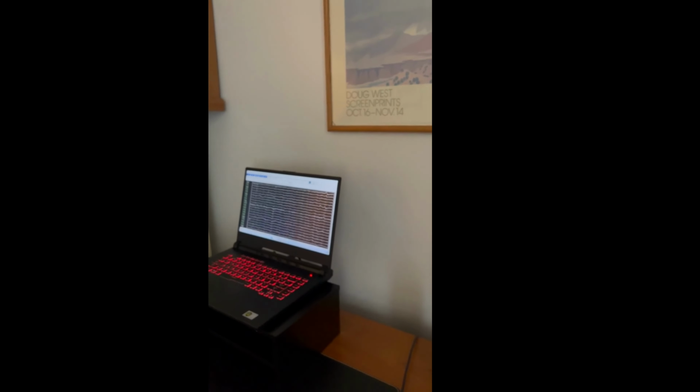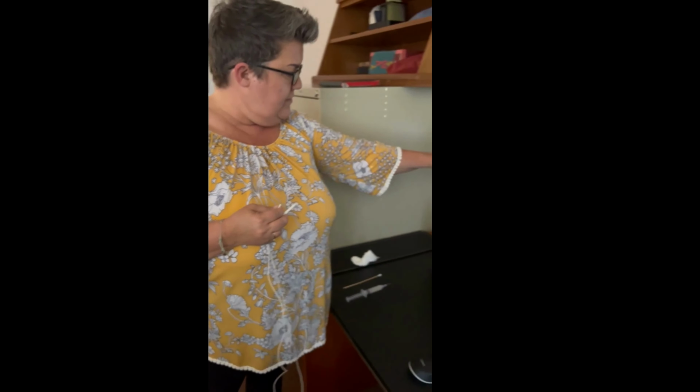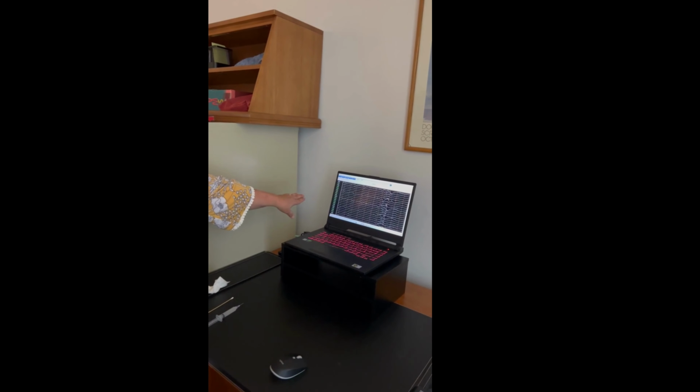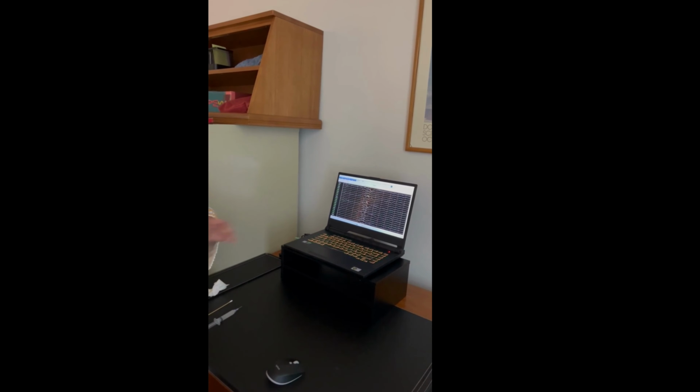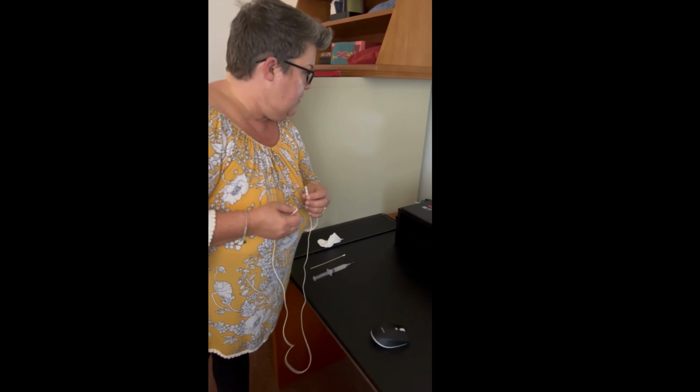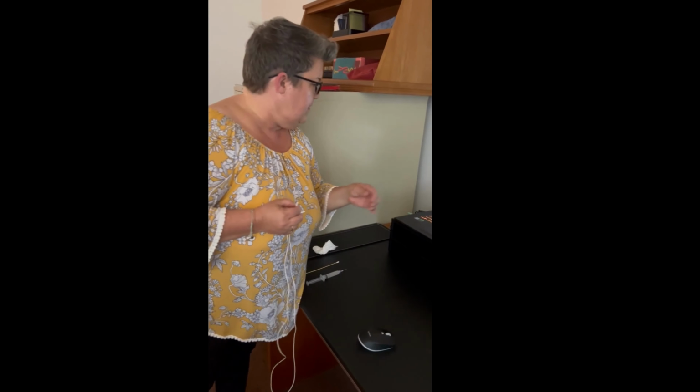I'm going to grab what we call a quick insert cord. So this is what's called a quick insert cord. And I affectionately call this a jumper cable. What you're doing is, when you're looking at your sites, if you have an area that you are not able to get under a certain number, and you've tried everything, you've rocked it back and forth, you have used your Q-tip, you've added more gel, what we're going to do is put this in an area that's a little bit high.